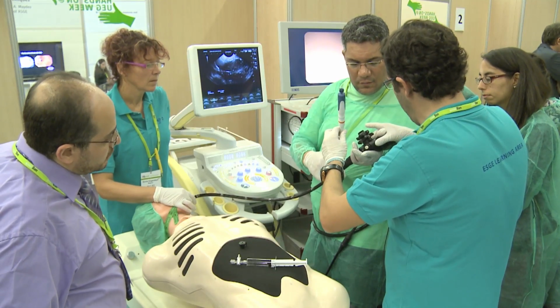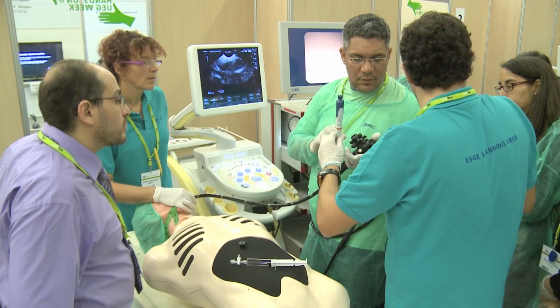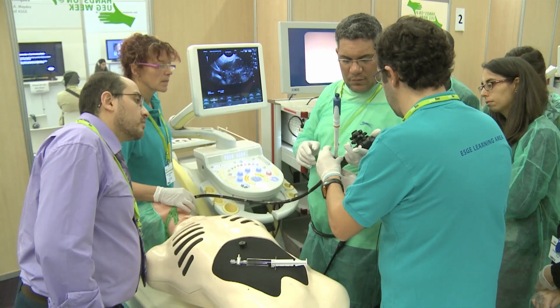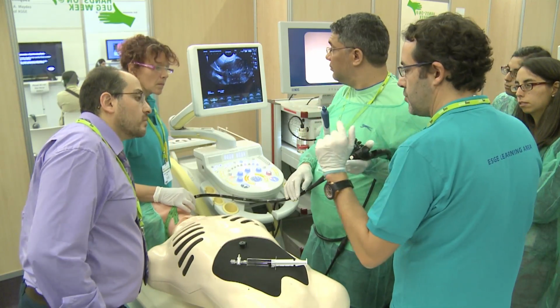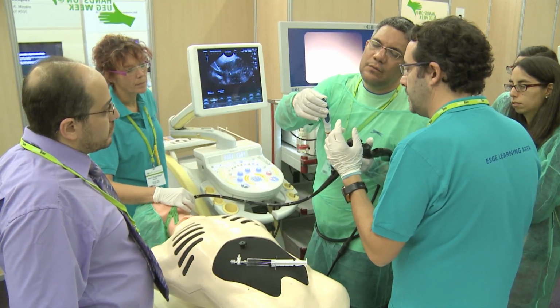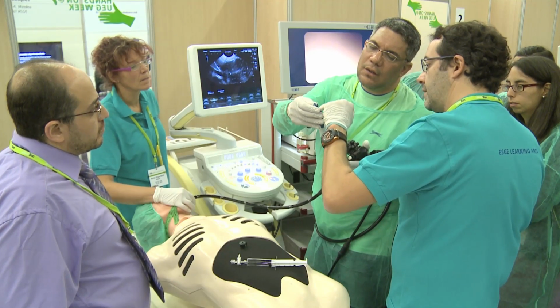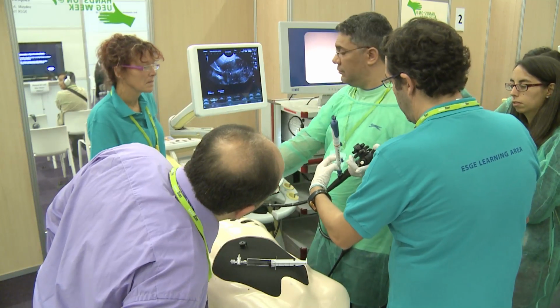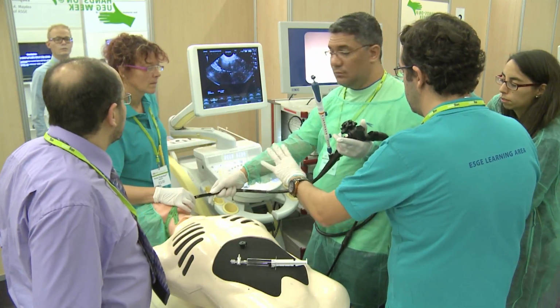So we always need to have the elevator down, so it's going to be easier for the sheath to go out, and then we just need to push and secure. So now it's your turn. This is a cytological needle, so the first thing is to remove the stylet a little bit. Do it a little bit. And in the Boston needles it's easy because you just go until the white part. That's okay. Keep it there. No, it's okay, it's perfect.